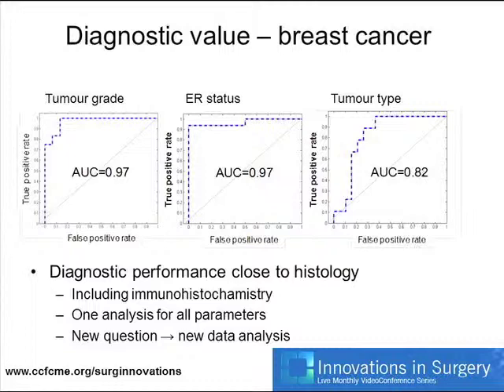I mean, that's a slightly inflammatory statement, but it's designed to try and stimulate some discussion. And what we hope is that we're able to get data that is similar to immunohistochemistry, and we get one analysis to measure multiple parameters based on the analysis of multiple different lipid features and small molecule features of a tumour as you're biopsying it in near real time.